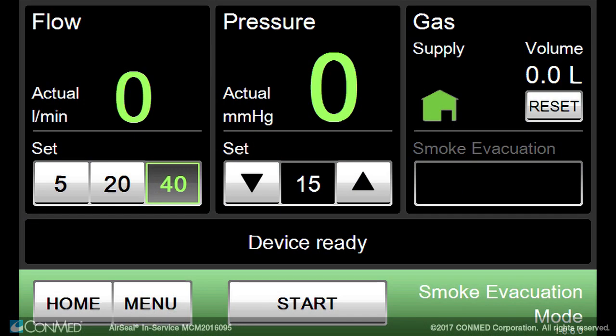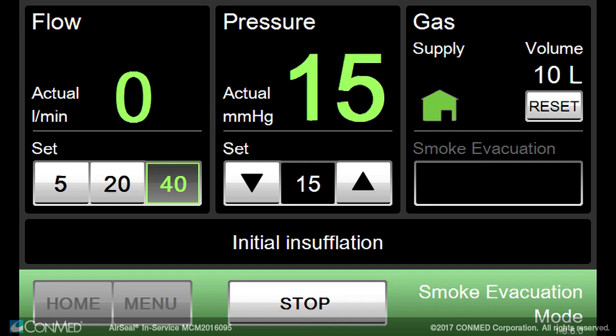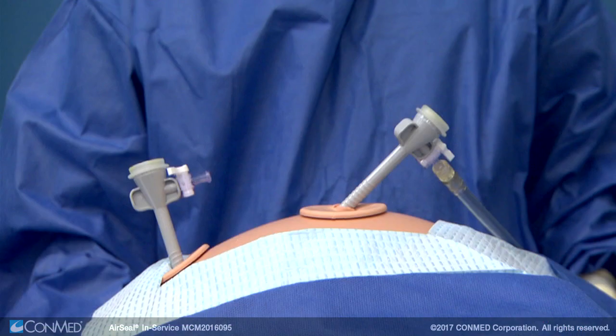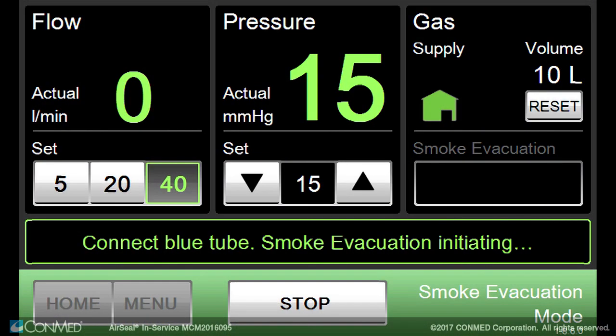Press the start button on the touch screen display to begin initial insufflation. When the insufflation is stable and after the first trocar is inserted if using the Veress needle, insert the second trocar and wait for the touch screen display prompt to ask you to connect the blue tubing.